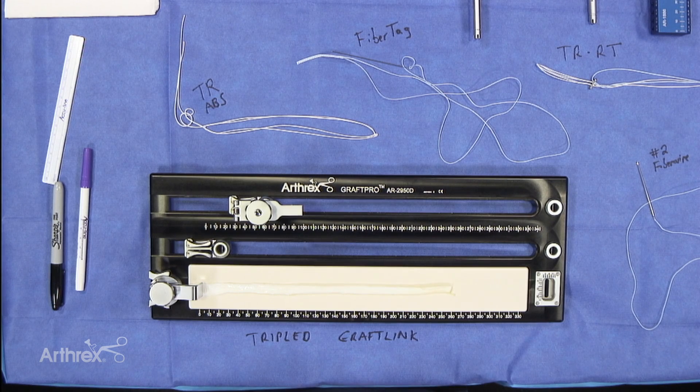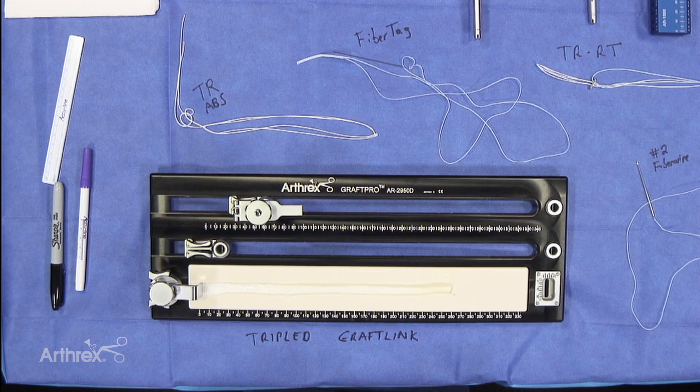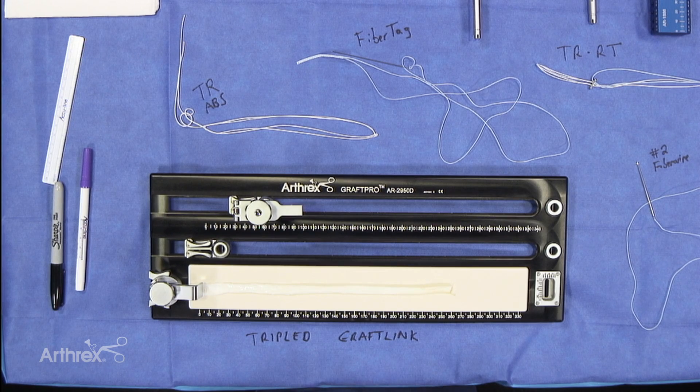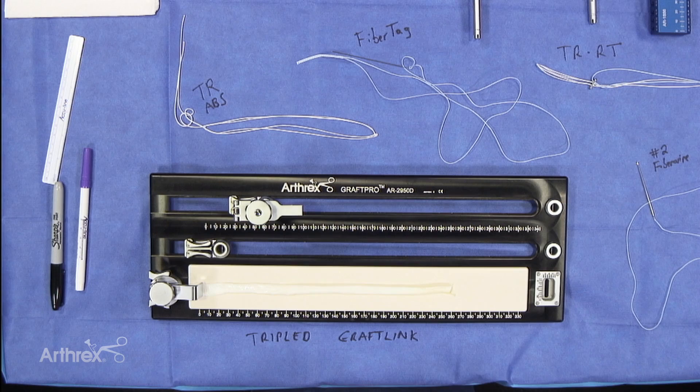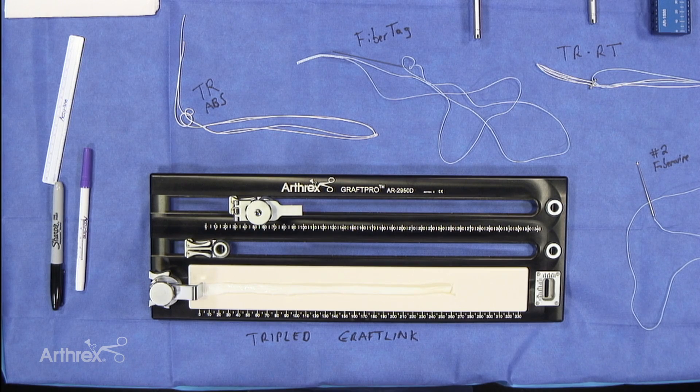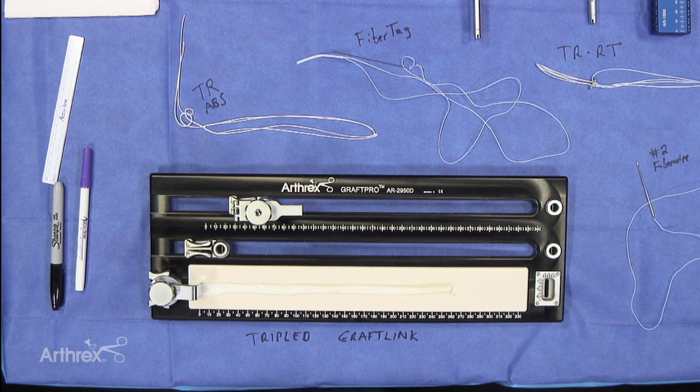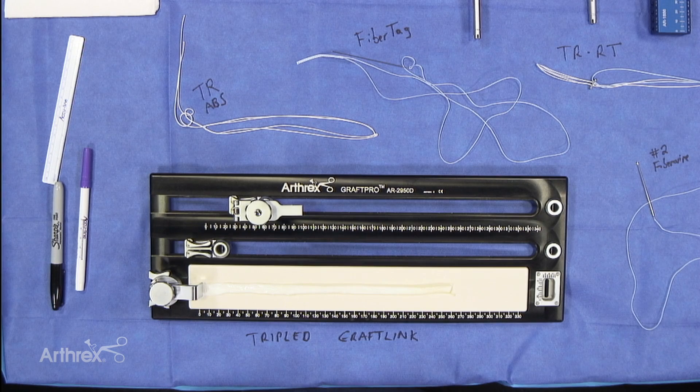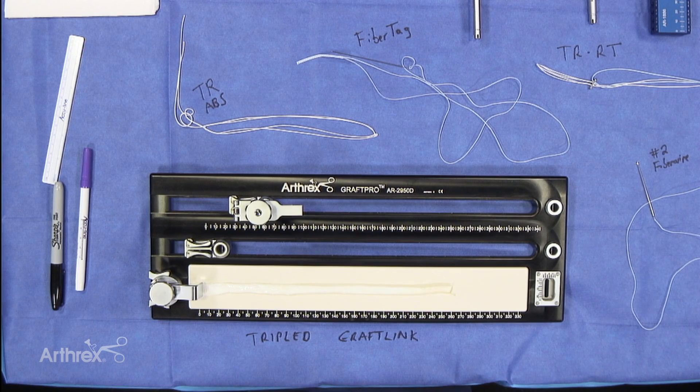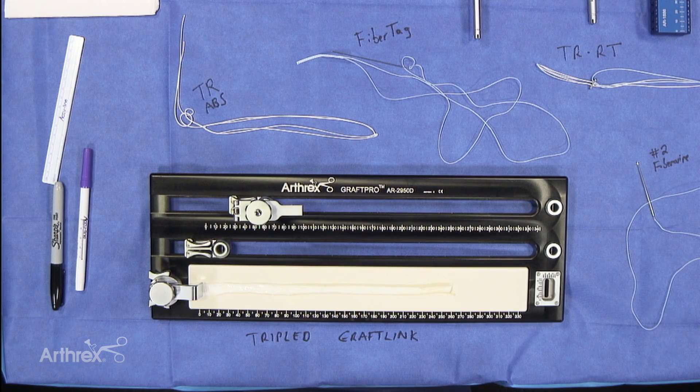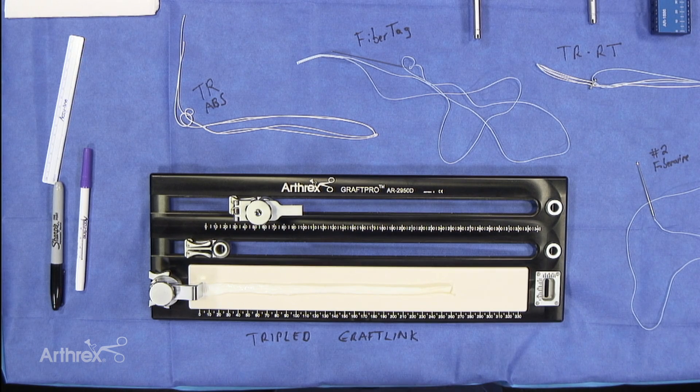Today we're going to show you how to do a tripled graft link using a graft that will be folded over in a triple fashion instead of a quadruple fashion. This allows you to use a much smaller length graft. This graft we have today is about 25 to 26 centimeters, and those graft lengths are readily available.